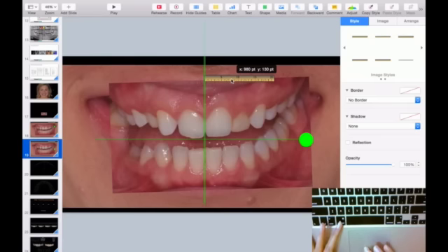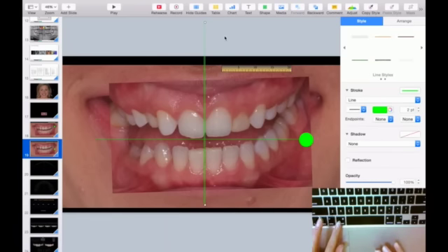That does not show. If you look at the patient front on, you never see a quarter of a millimeter shift of the line. What you see is if the midline is tilted. So if the midline is like this, you'll see it from far. So it's important that the midline is never tilted, it's always straight.